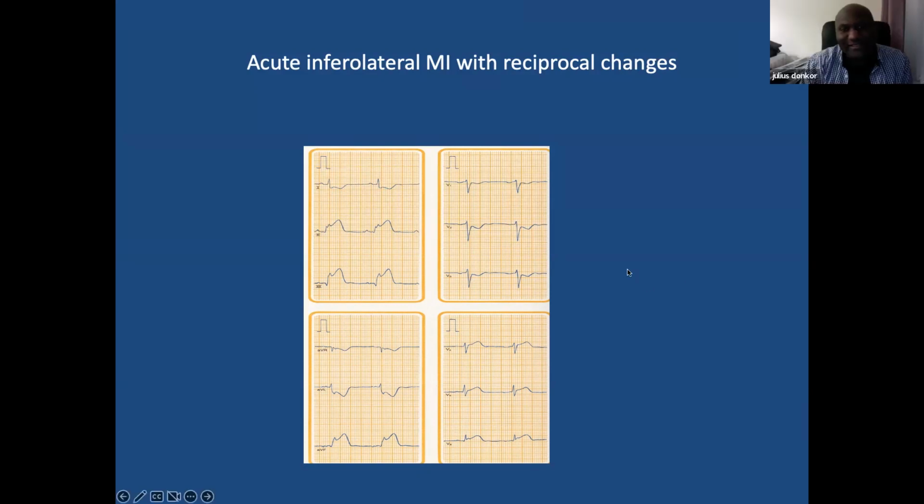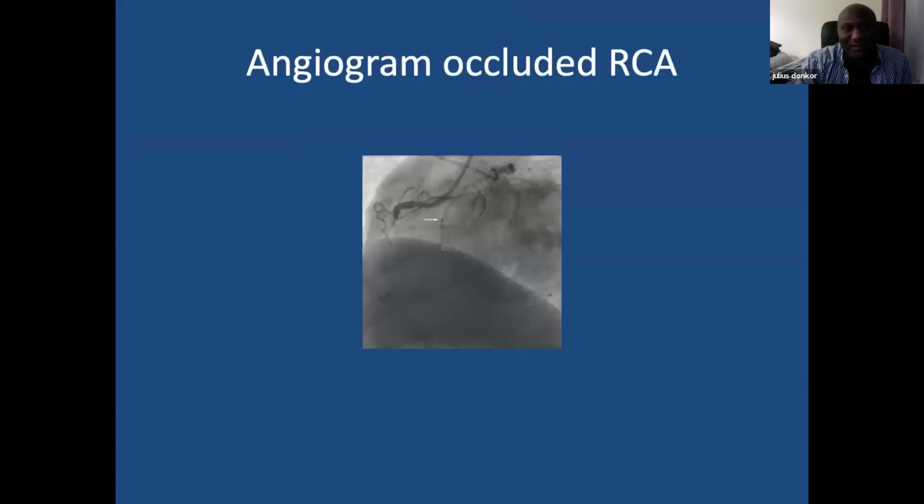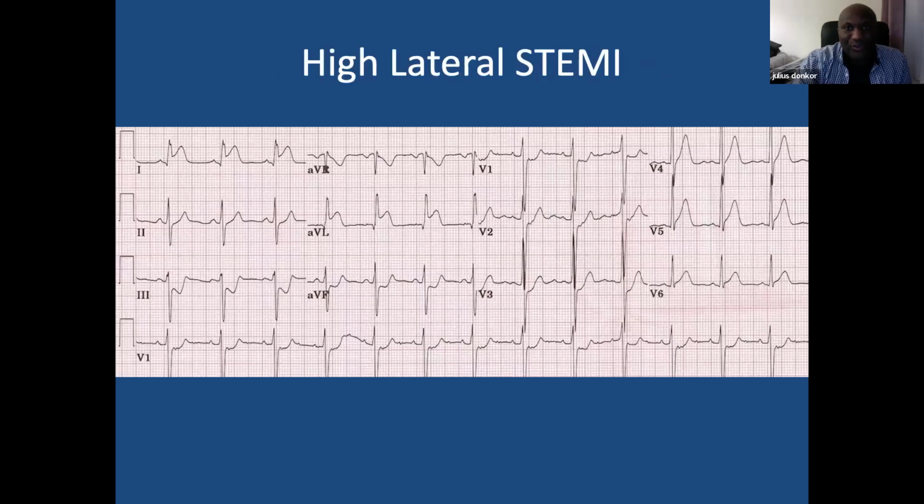You agree with that, Dr. Daffy? The artery is dominant, so it goes beyond the crux of the heart. Yes, we explained that for us. Yes, excellent. Right, let's move on. So yeah, that's the right coronary artery, quite proximal. Right, okay. So we've a high. Is that okay?